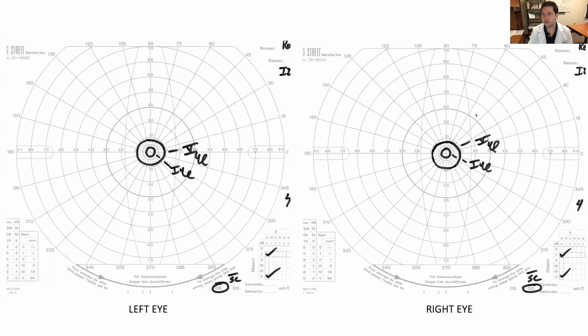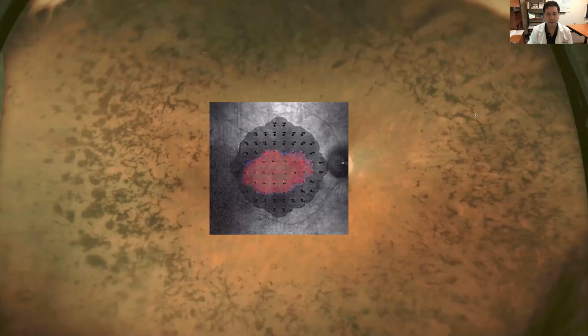And in most countries, patients with visual fields below 20 degrees would be classified as legally blind. So this patient would be significantly disabled in their daily visual functioning and would need significant assistance in orientation and mobility. If we do microperimetry, overlay that with the autofluorescence and the fundus image, we can see that yes, there is a preserved island of sensitivity in the central macula, but outside of that central macula, in the peripheral macula and in the periphery, the patient does not have any significant sensitivity on psychophysical testing.